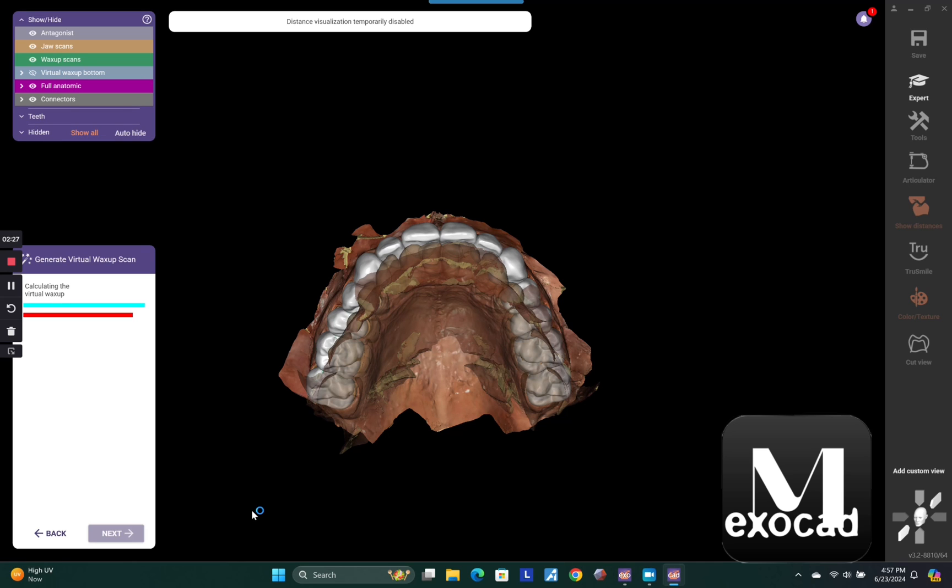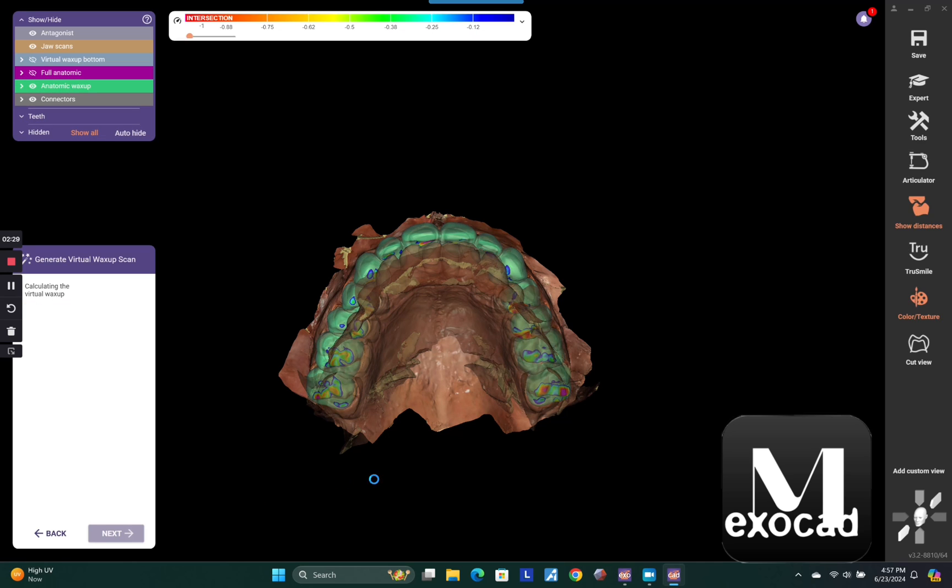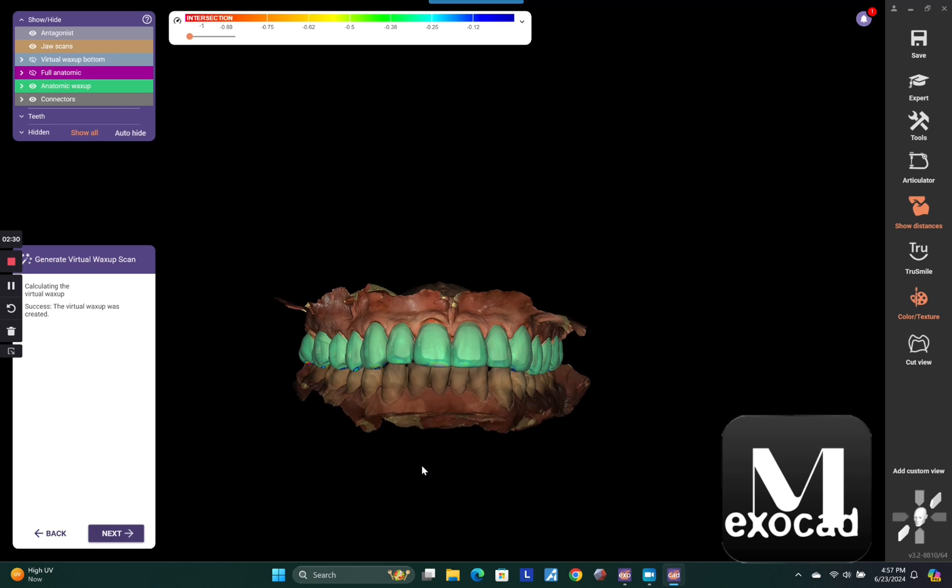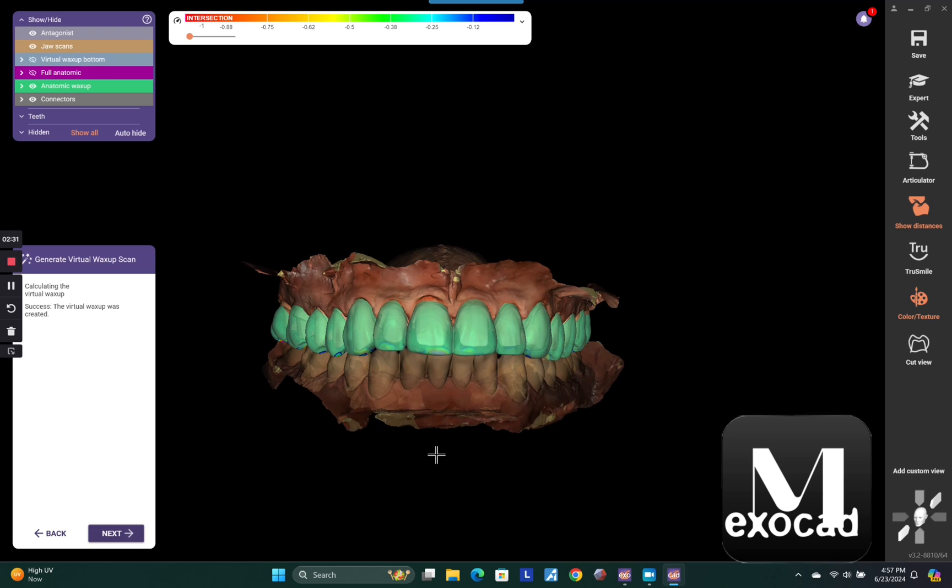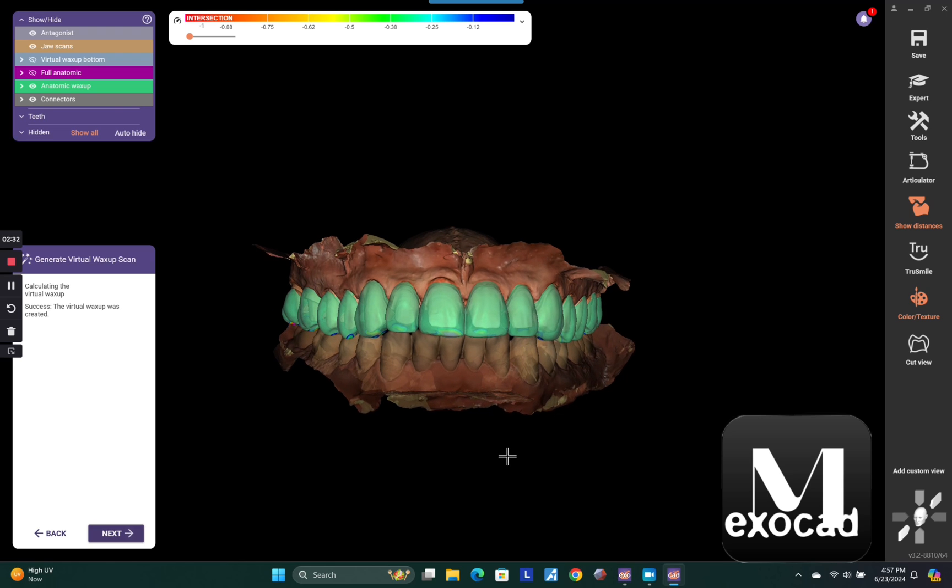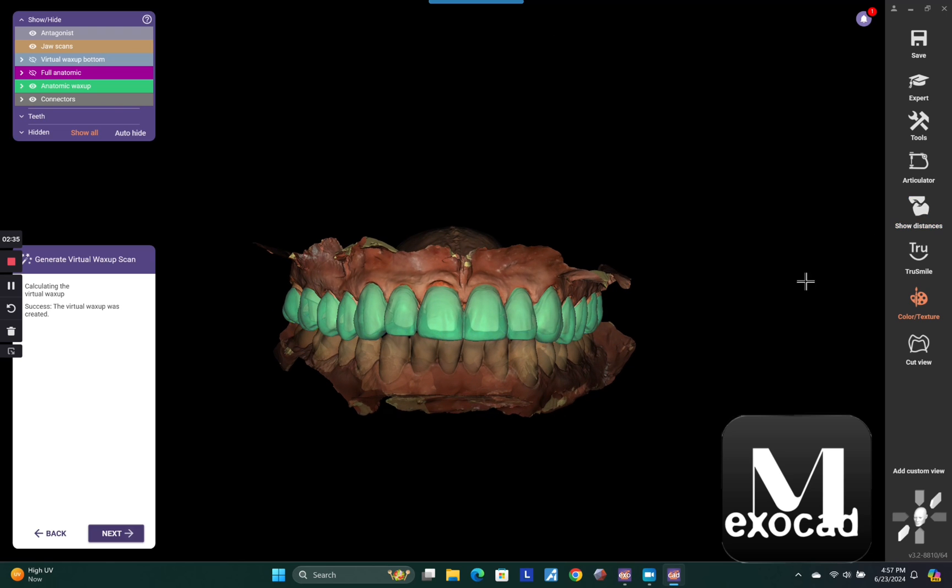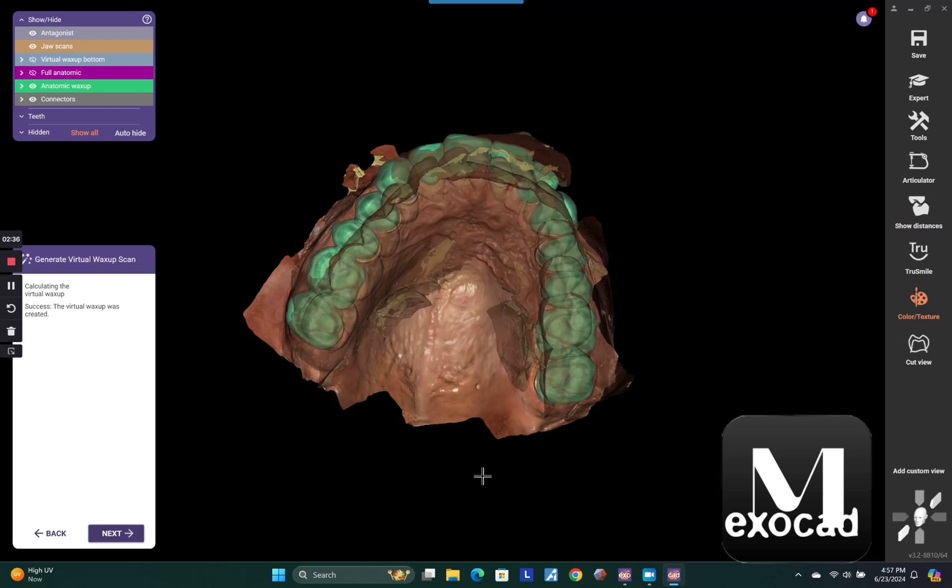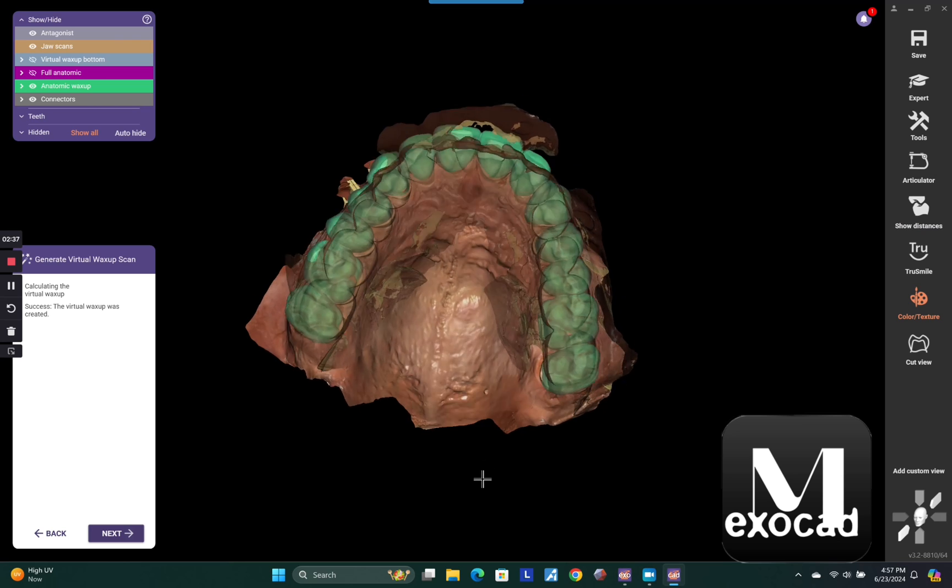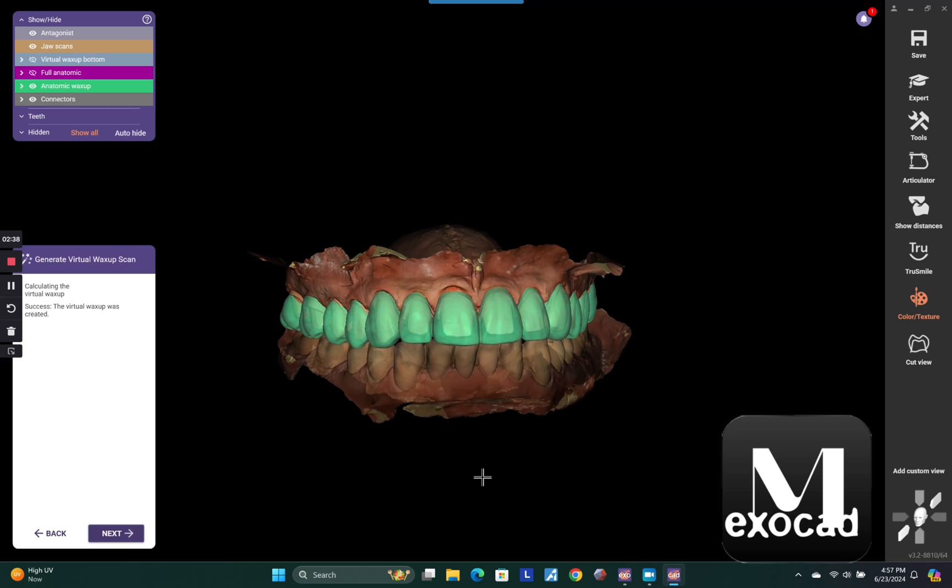So now we're going to just go ahead and follow the wizard. You're just going to generate the virtual wax up scan, which is this kind of Ninja Turtle green wax up. And from here, you're just going to hit next.